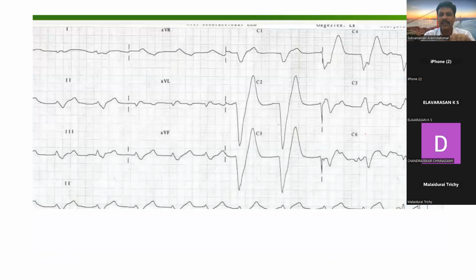So we'll see that. See here, in a real world scenario on an ECG, you are not seeing a P wave. The QRS is wide, and it is almost merging with the T wave. There is no ST segment, a completely wide QRS, no P wave, and a tall T, and it is almost merging together. This is typical of hyperkalemia, with potassium around 8. If you happen to see this ECG, it means the patient is in hyperkalemia, probably from acute renal failure.